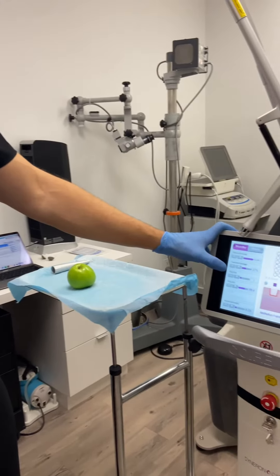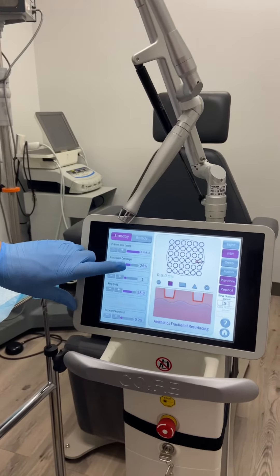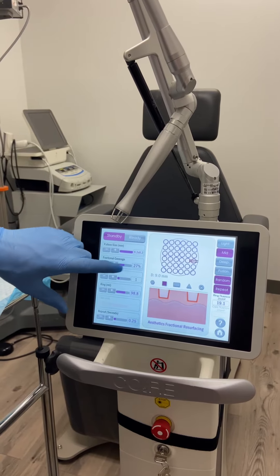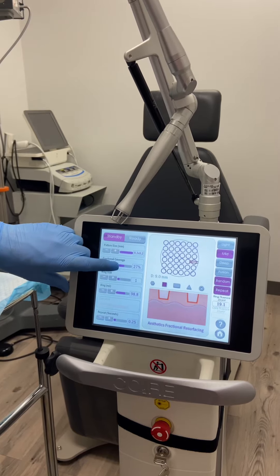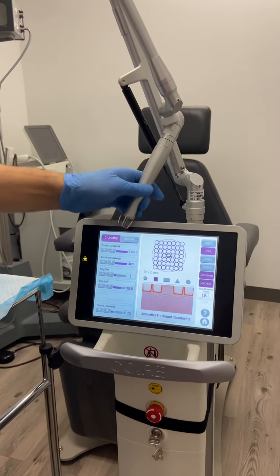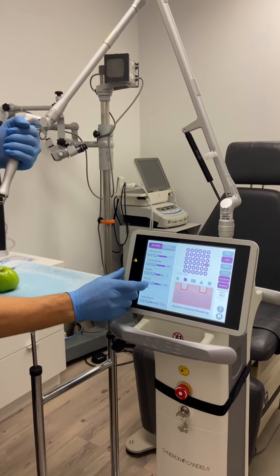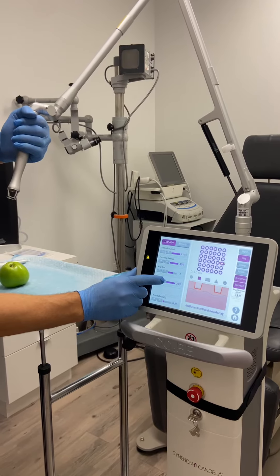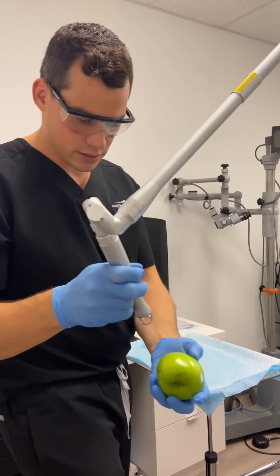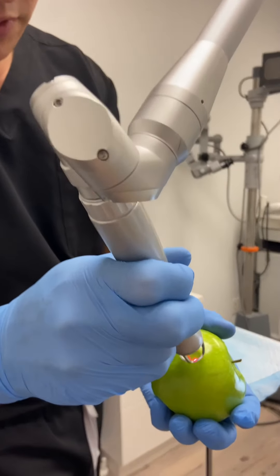When we're treating someone's skin, we're almost always on deep mode and mid mode. With mid mode, I can change the fractional coverage. If someone has dark skin — Indian skin, Fitzpatrick three and above — I'll have the percentage down, but this is safe in all skin types as long as you change the coverage. For Caucasian skin, we can go up to 40%, and I'll go ring size two. We can change the energy. I'm going to put it up all the way so you can see what it does for an aggressive treatment for something like deep acne scars.